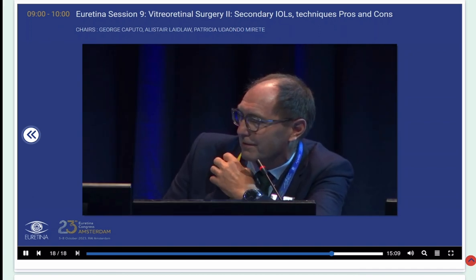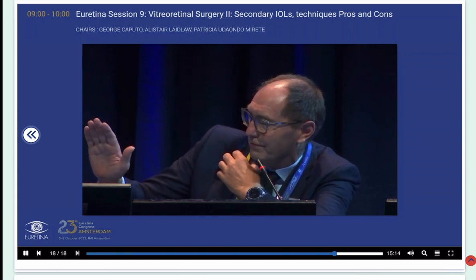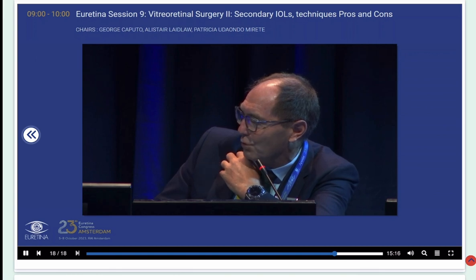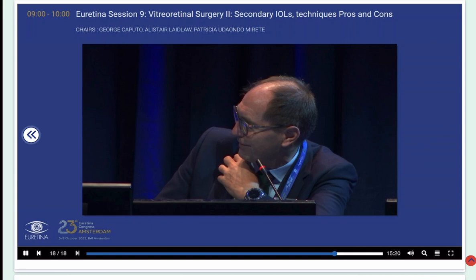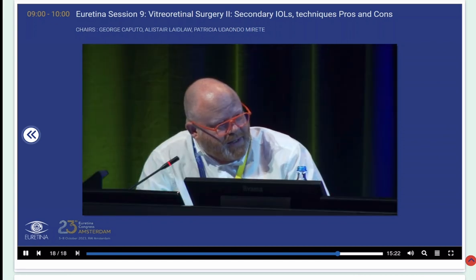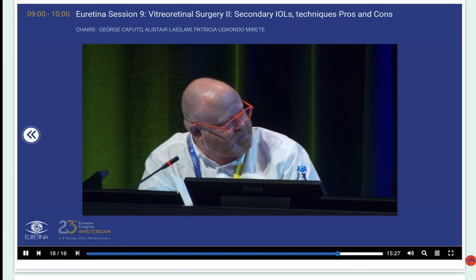I guess it might be that it's quite a big optic relative to the pupil size in that respect. So, when you're doing these scleral tunnels, in order to reduce the astigmatism, how far into the cornea are you coming out on the corneal side, on the endothelial side? Just barely where you actually see it, so you come very close to the place.